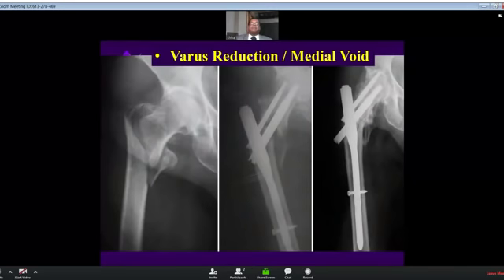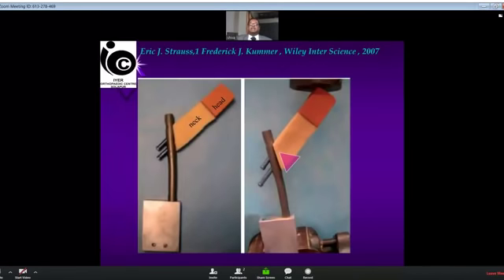The next commonest cause is the medial void. In an unstable trochanteric fracture, where the lesser trochanter is broken, there is a gap medially, and that gap requires to be collapsed. As said earlier, the inferior part of the head and neck tries to collapse more than the superior part, and that leads to jamming of the superior screw, and hence the Z effect happens in these cases. And you can see, fortunately, the fracture united by this time, so the Z effect has started in this case.